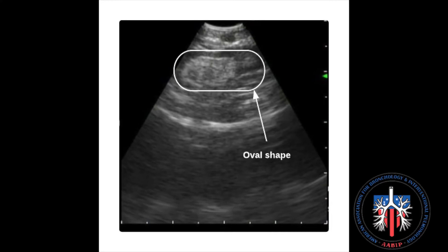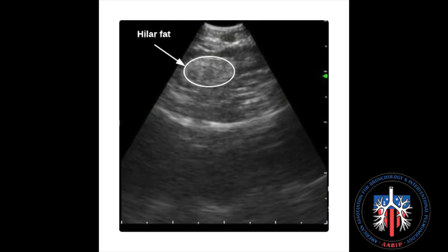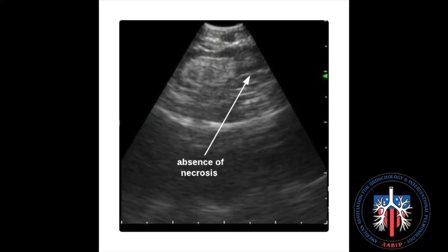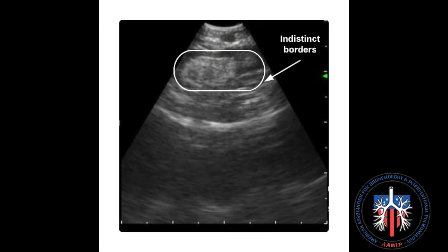Features of a benign lymph node include oval shape, hylar fat, absence of necrosis, and indistinct borders.